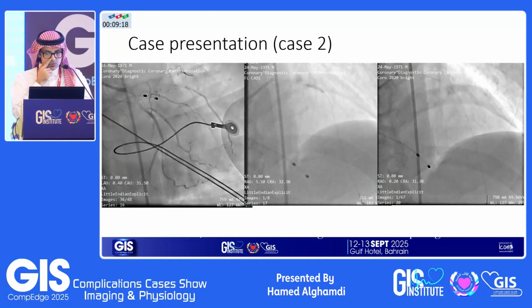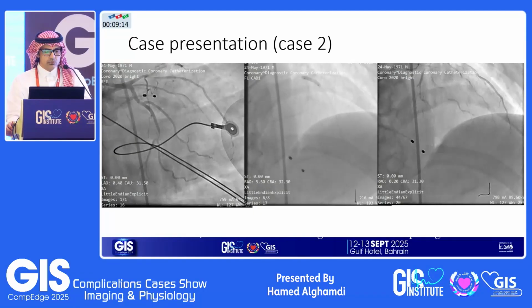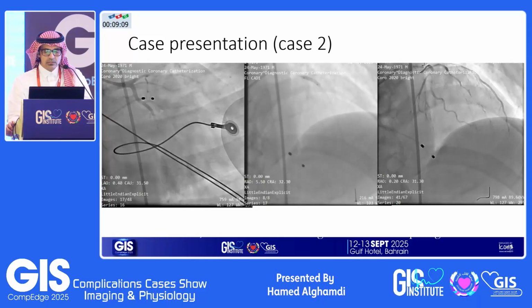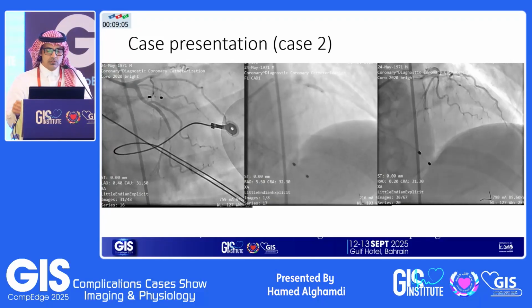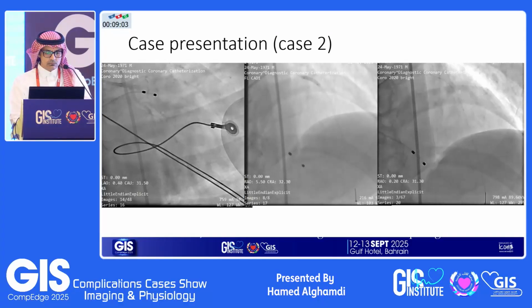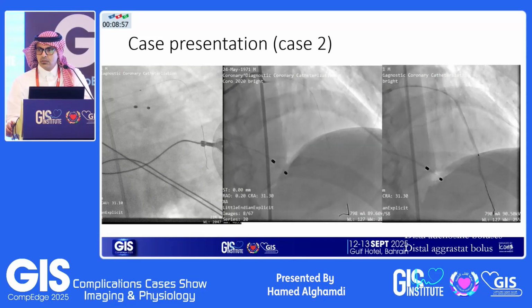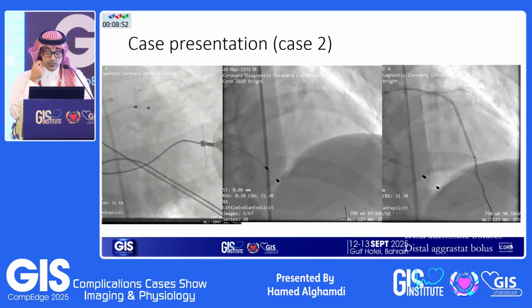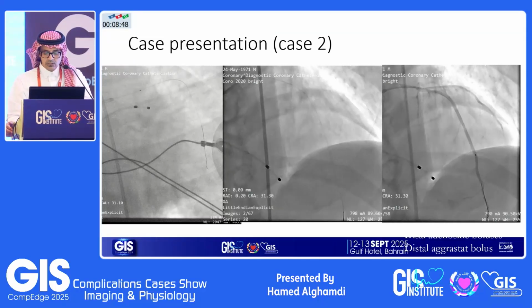His hemodynamics were soft, so again, we did gentle pre-dilatation with a 2.0 balloon, and you can see on your right-hand side there is nothing. So even that TIMI-1 to 2 is gone, and his blood pressure was in the 90s. I should mention that his LVEDP was 38.